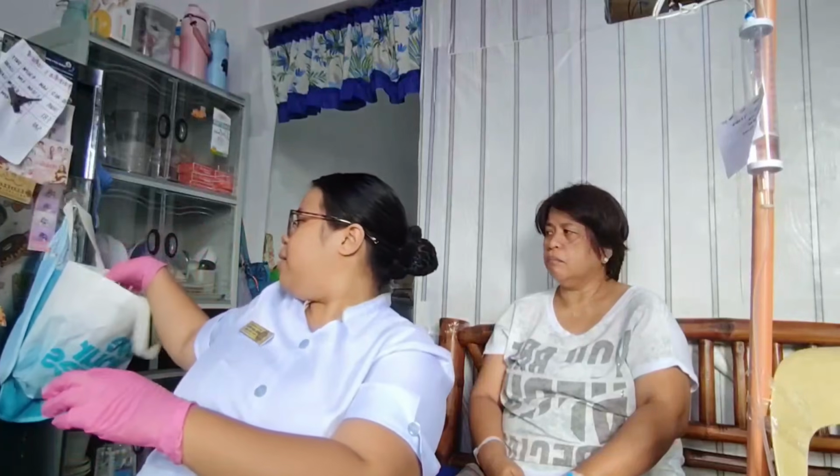So, after that we're going to dispose all the materials that we have used into a proper waste receptacle according to the healthcare waste management and the infection prevention and control policies. So, we're going to put this into the sharps. And then make sure to dispose the materials that we have used into a proper waste receptacle. Then after cleaning our area, we're going to remove our gloves and then perform hand hygiene after the procedure.